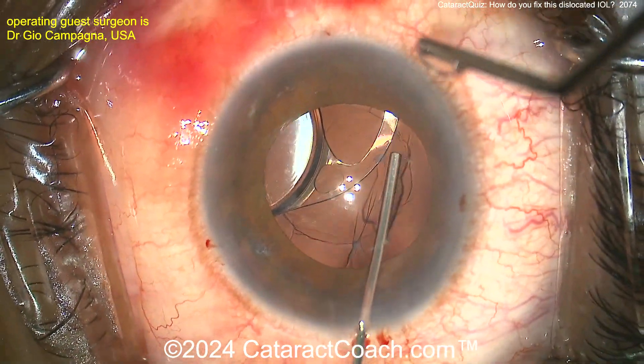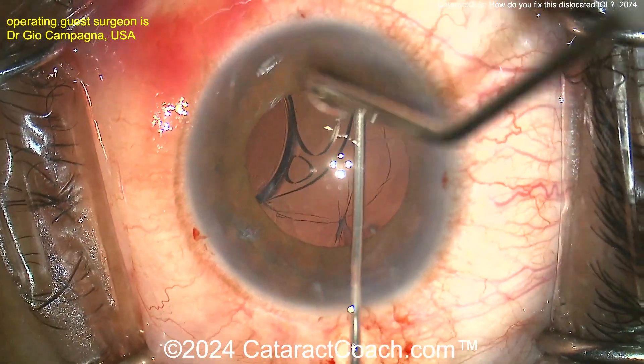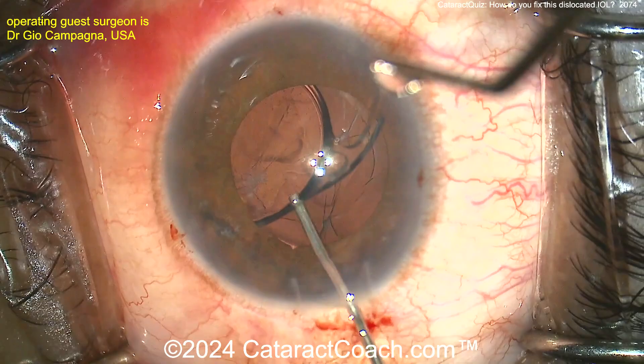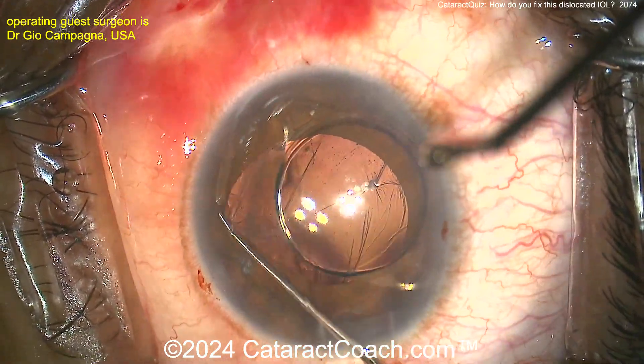Let's take a look at what the surgeon is going to do here. This lens looks like it's maybe partially in the bag but it's severely dislocated. There is some capsular or bag support. I like the idea of using viscoelastic to kind of dial it up and see where we are. Perhaps it was partially in the sulcus — that's causing a lot of iris chafing. Now, do you keep this lens or not? That's the question.